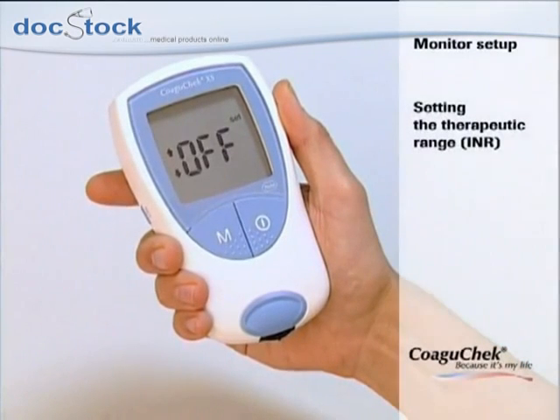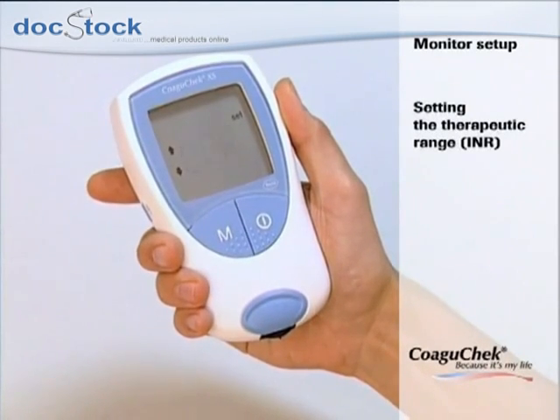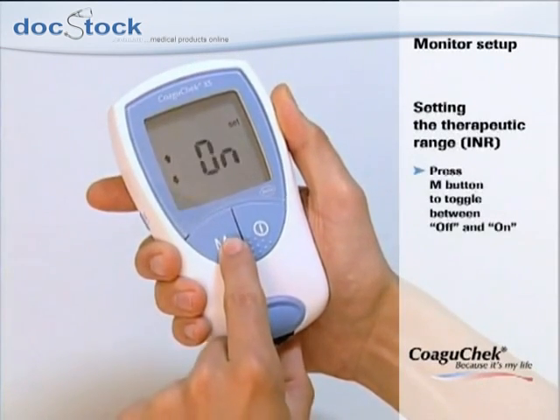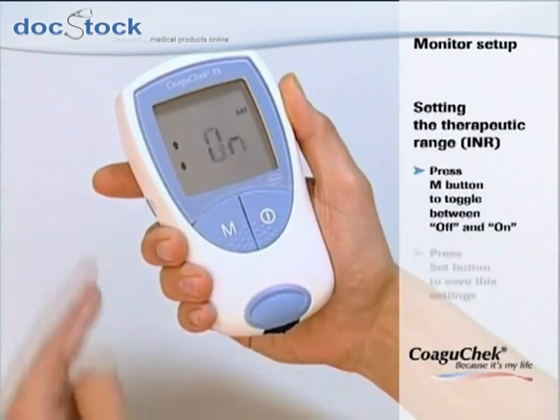The display automatically moves on to the next setting option. If you selected the unit INR, you can now choose whether you want an additional element to be displayed. This shows if the result is above or below your therapeutic target range. Press the M button to toggle between off and on, and press the set button to save your setting.